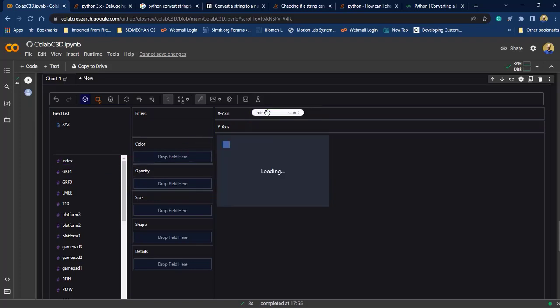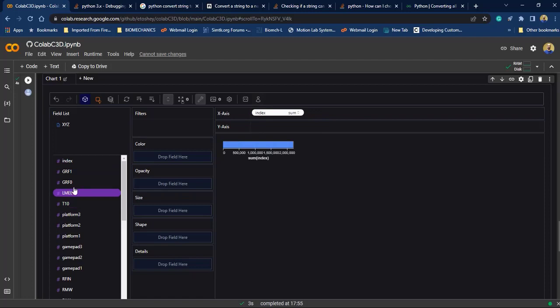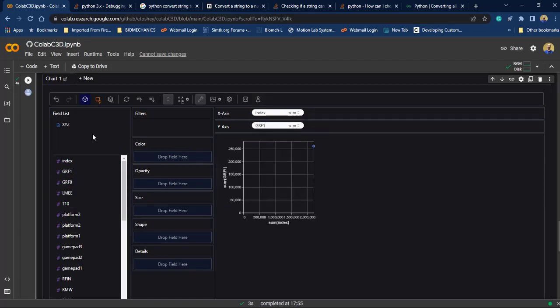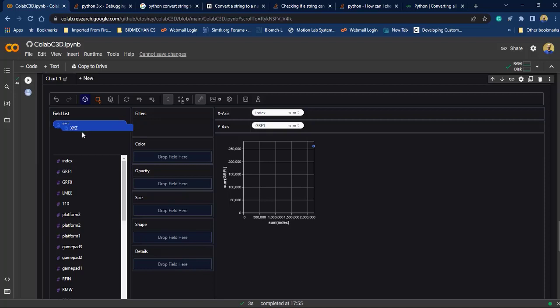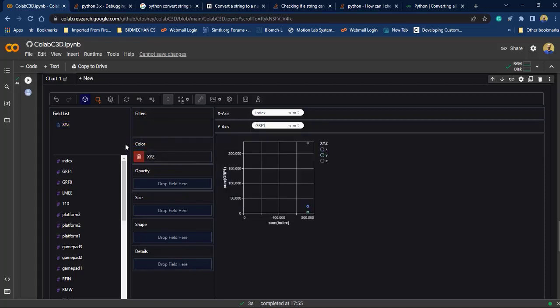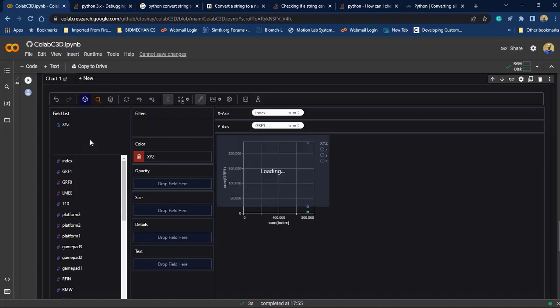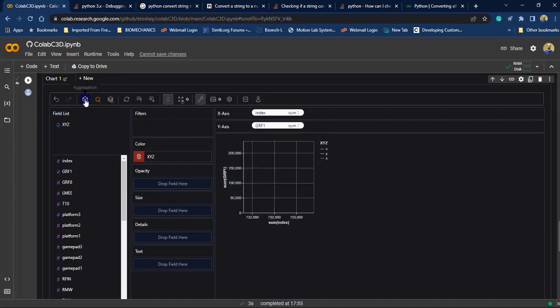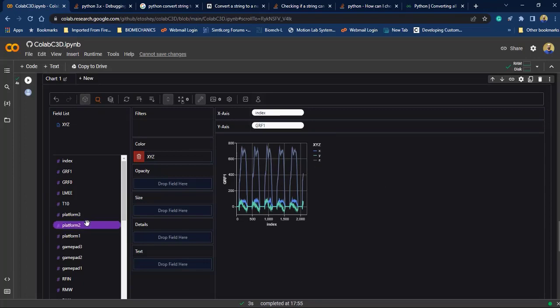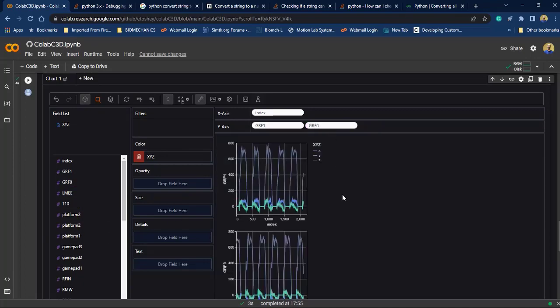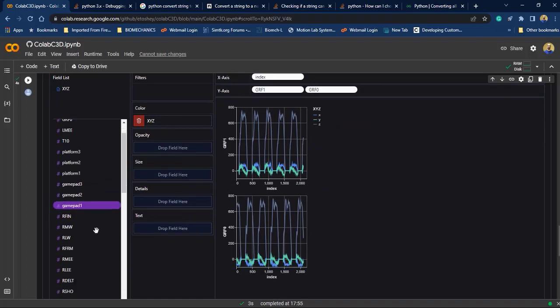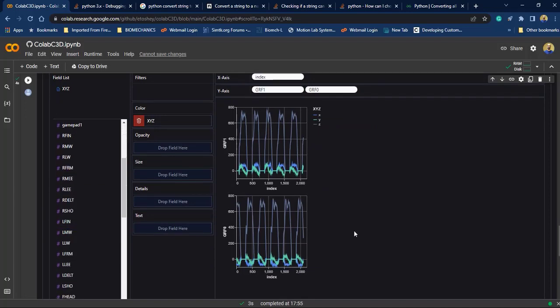Using this parameter XYZ to create a separate series, change the type of chart to line and disable the aggregation. And for another plate, we can also plot a marker position, for example this marker.